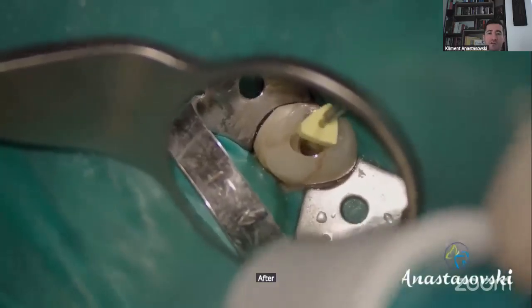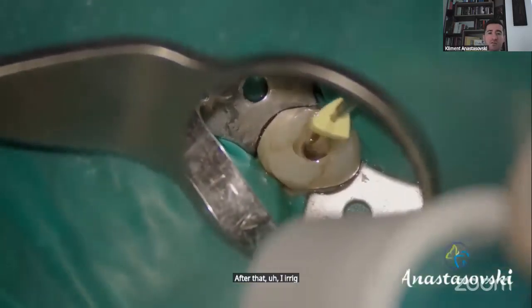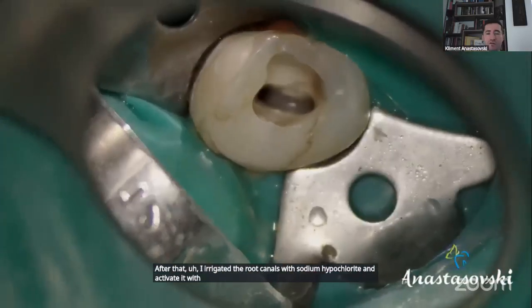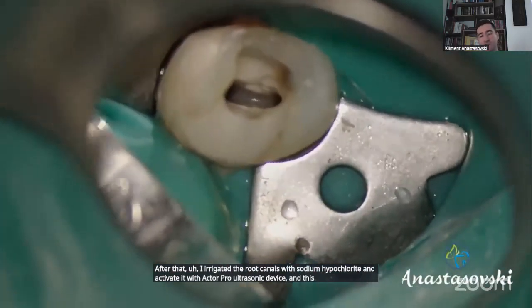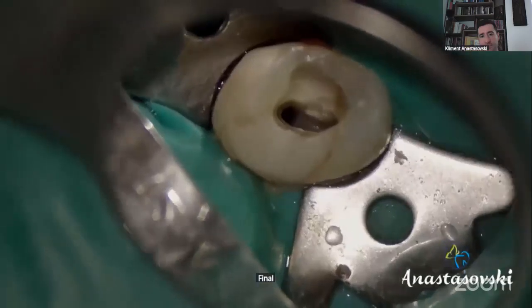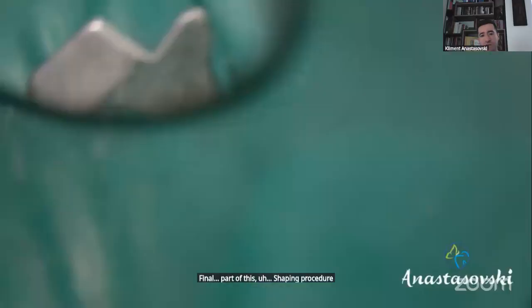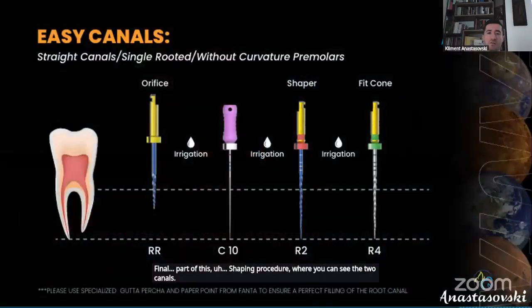After that, I irrigated the root canals with sodium hypochlorite and activated with the Acteon ultrasonic device, and this is the final part of this shaping procedure where you can see the two canals shaped very well.